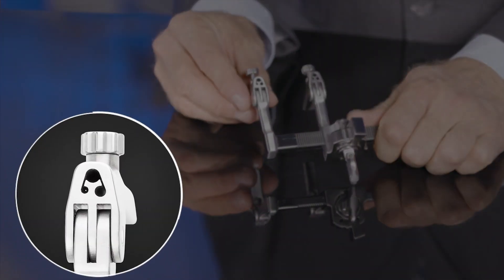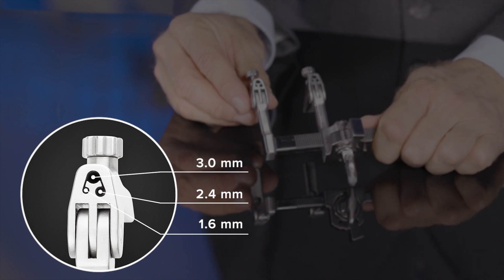There are three holes on the distractor that can be used to accommodate different size pins: a 1.6, a 2.4, and a 3.0.